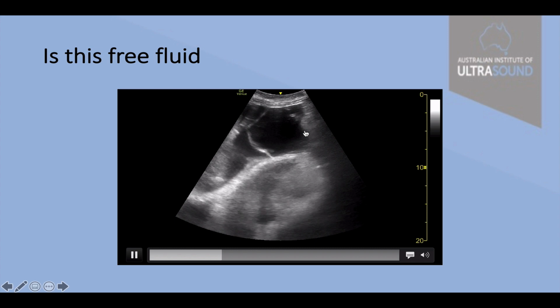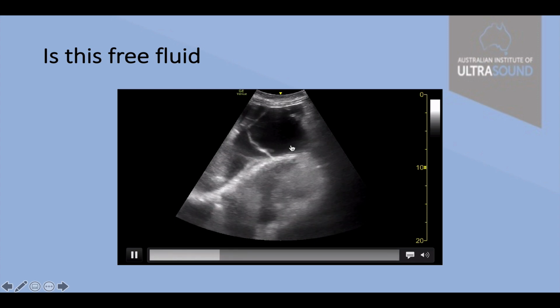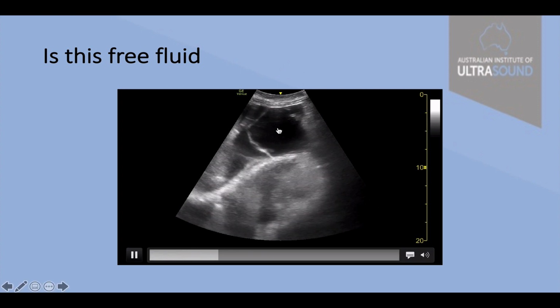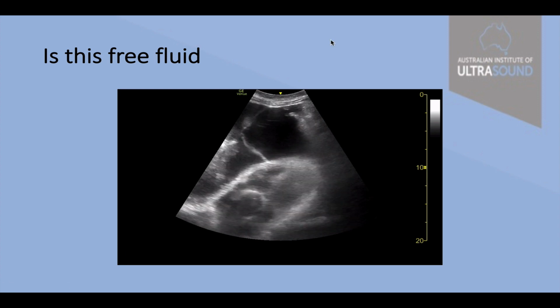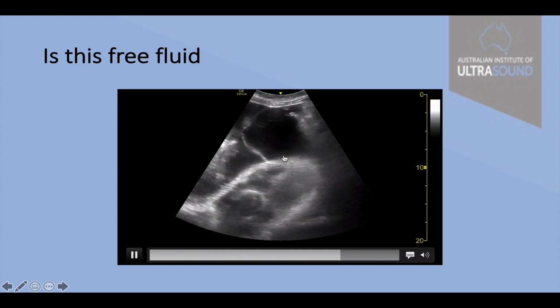But you'll notice that there is a large fluid collection anteriorly. Well, it seems to you that it's anterior to the heart, certainly superficial to the heart, but this is because we're beaming the ultrasound up from the epigastrium. We're actually passing through quite a bit of ascites before we get to the pericardium.